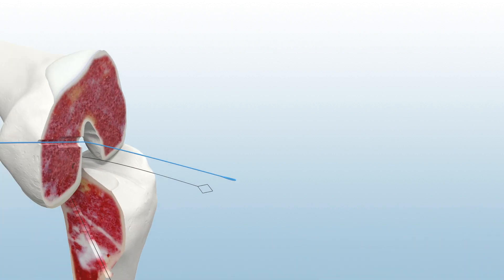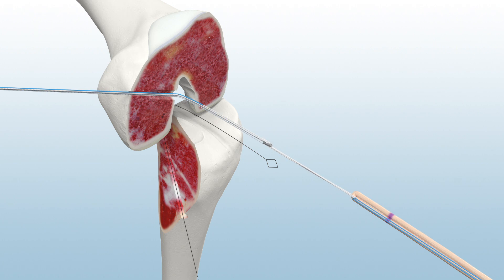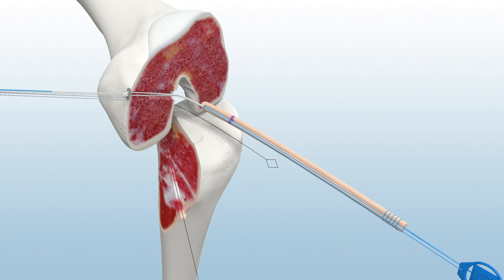To pass the graft, load the Infinity Femoral Adjustable Loop Button's lead and tensioning sutures onto the femoral passing suture. Under direct visualization, pull the lead sutures while removing slack from the tensioning sutures until the button is seated on the lateral femoral cortex. Distal tension on the graft construct will confirm seating.